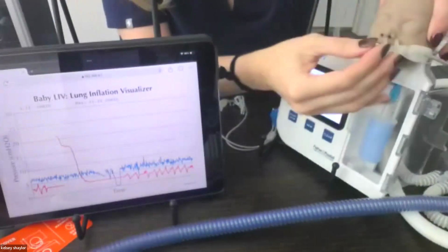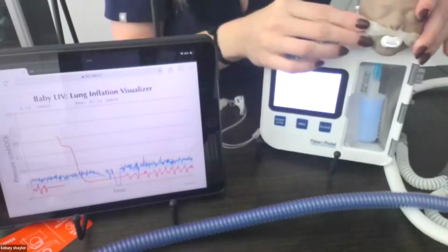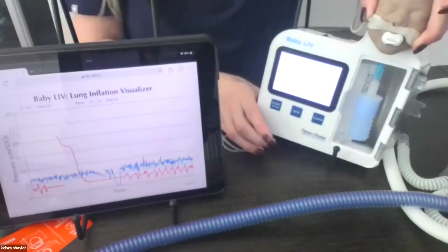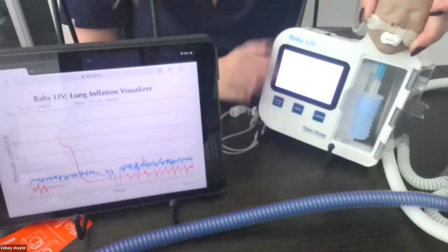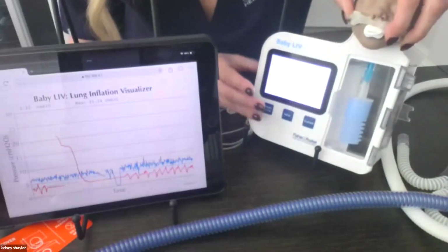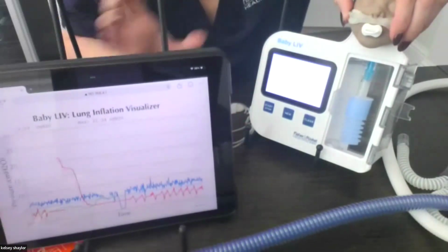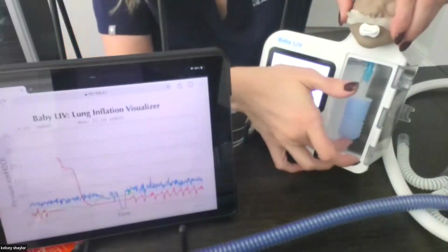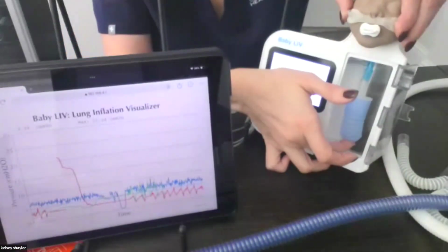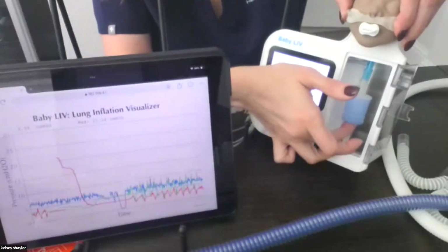When I look at this guy, always a little tricky upside down. But we're going to try again. All right, and this line should be green if you all can see it. I know this one's probably the hardest color. I don't know why they had to choose neon green, but it does make it a little bit tricky to see. But if you can see, we are getting a little bit of those higher pressures, and I'm at 6 liters still, but I'm looking more in the world of what we were getting with CPAP, right?